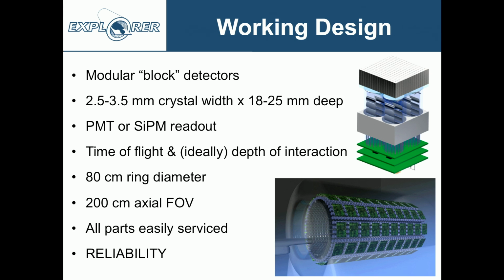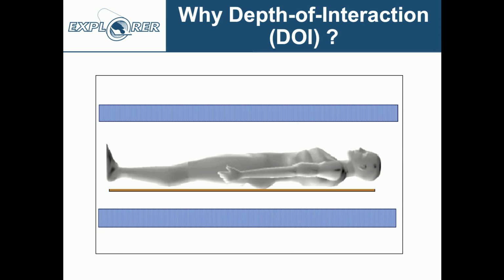And we've talked about this. This is really key with so many detector elements, so many channels of electronics. It's all got to work very, very reliably. Now, I've mentioned this term depth of interaction a few times. So what am I talking about here?